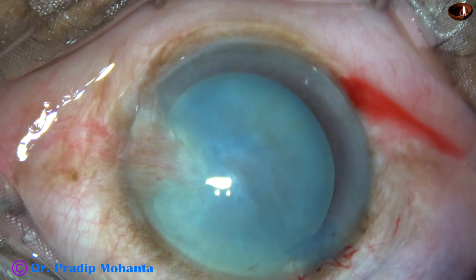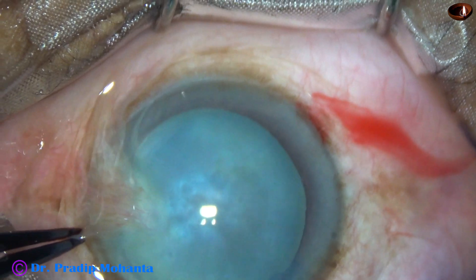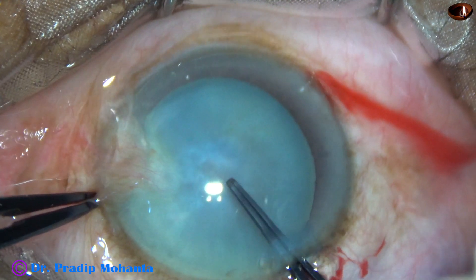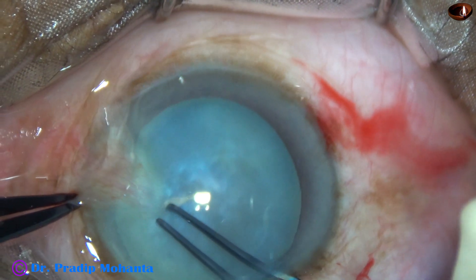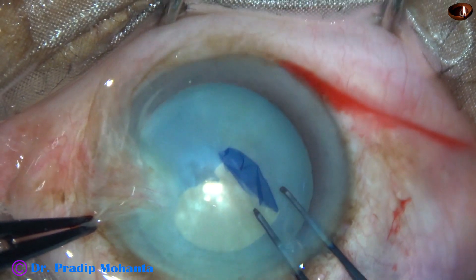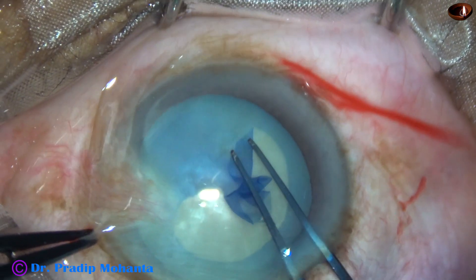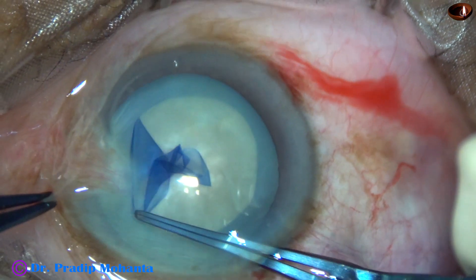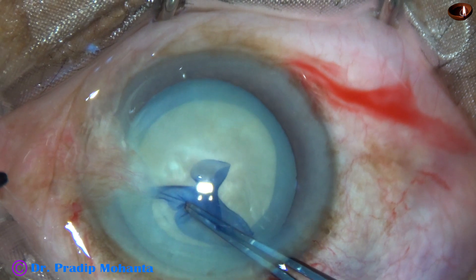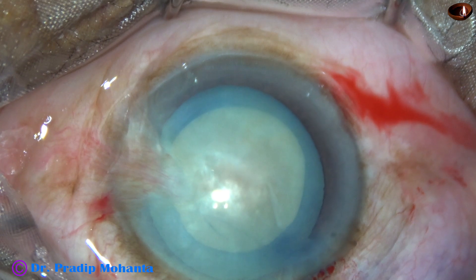I am going to use utrata forceps for capsulorhexis. Scratch onto the anterior capsule, raise the capsular tag, go all around, remaining at a certain distance away from the margin of the dilated pupil. And thus I could do a very nice optimum-sized rhexis, about 5.5 millimeters.